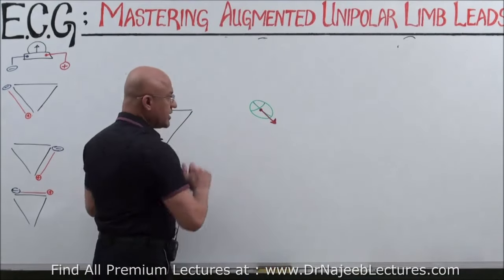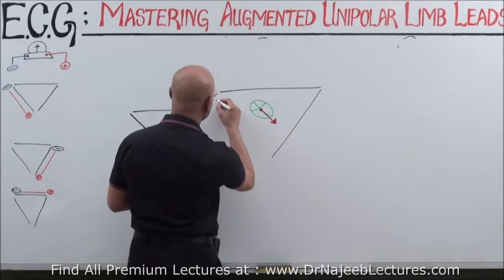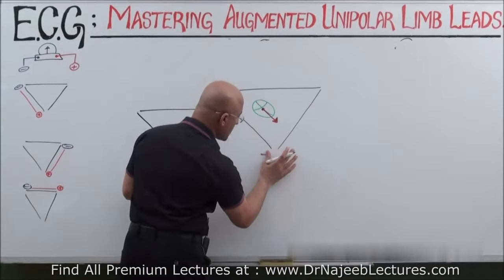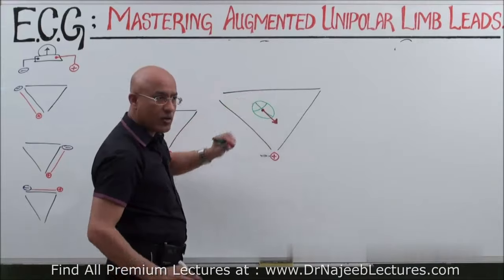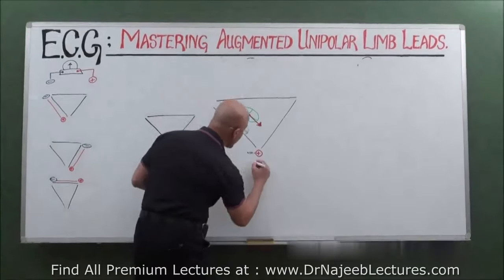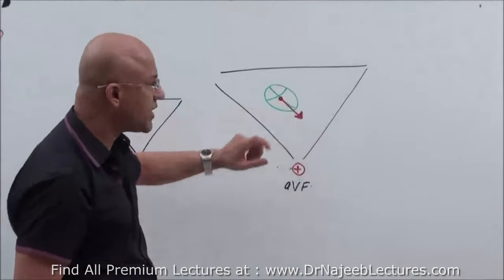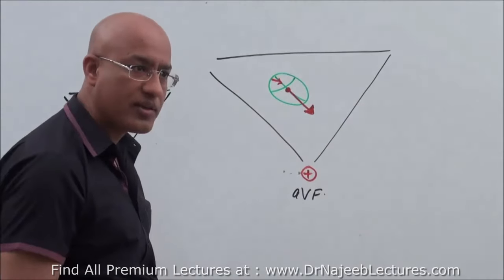Now, here is this, what we already did. If we put the positive electrode only here, and the indifferent electrode is here, this is augmented unipolar limb lead AVF. I'm not showing the negative electrode now. The positive or exploring electrode is put over here, and now it will look at the cardiac activity. Now three major cardiac activities: this is the atrial depolarization, and this is the major ventricular depolarization.